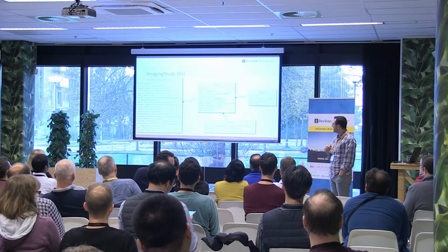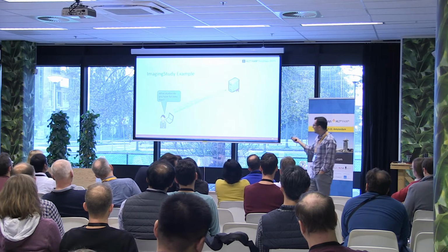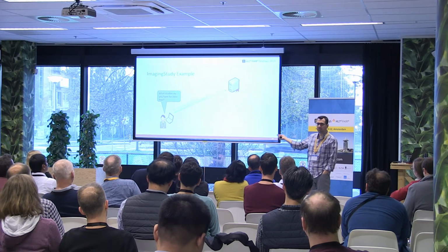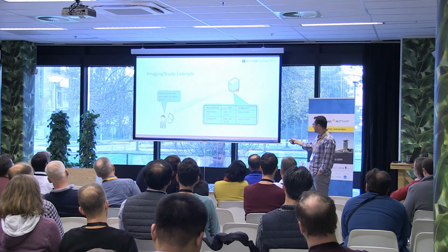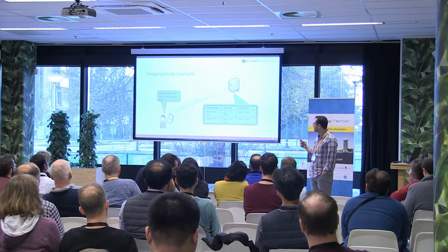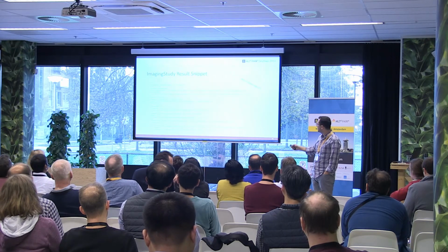Okay, so let's dissect some of that information. Oh, I guess before we dissect that, this is an example of what it looks like. So here, you could go and search a FHIR server for studies. Now, the example here, of course, is a poor example where we're searching by name. Hopefully you don't do that in real life. But the server responds and says, hey, I have 2 studies for this patient, and provides an endpoint to each one of them, so you can go retrieve them. And then somewhere here, we should get the example back. JSON response. Okay, again, don't worry about reading this, but here's a nice little response.